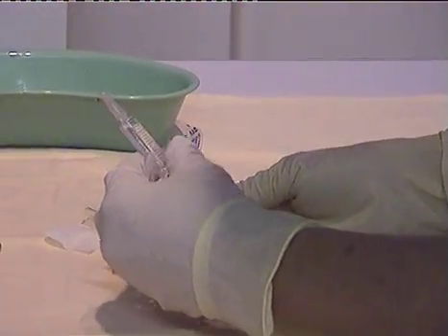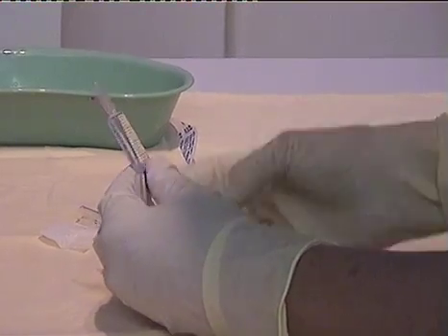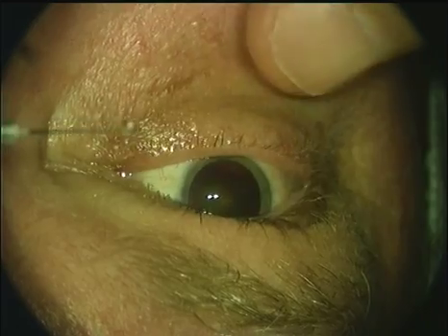We draw up two cc's of lidocaine with epinephrine. This comes in dental cartridges and is very cost effective.